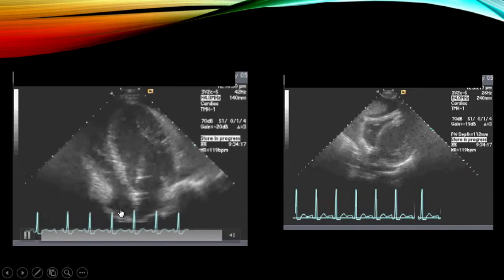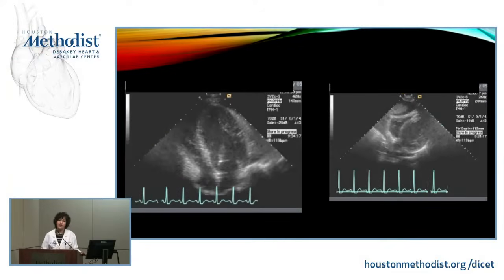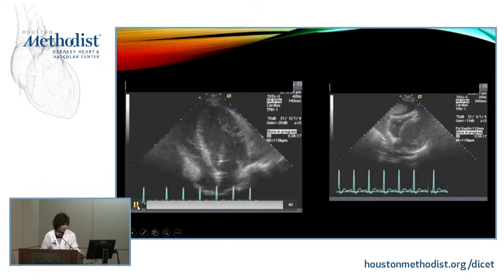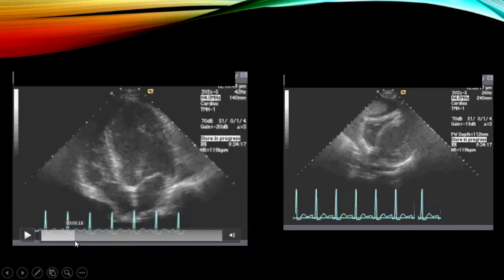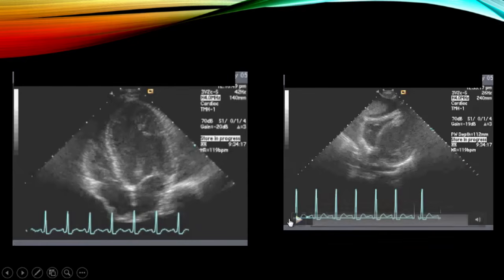Now you have to understand, and you have to slow it down, it's pretty tachycardic, that you have to differentiate atrial kick, where the atrium actually contracts, from a late diastolic atrial collapse. And you would have to slow it down and time it. There is a subtle, if I can slow it down. Okay. So, if we can phase it, you see the atrium come in, go out, and then come in again a little bit. But it is not staying in for most of the late diastolic period, but there is a subtle finding here.